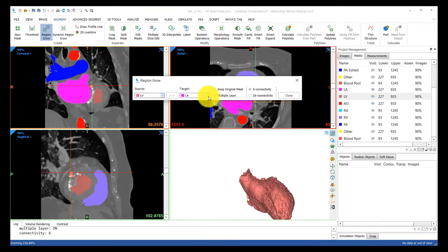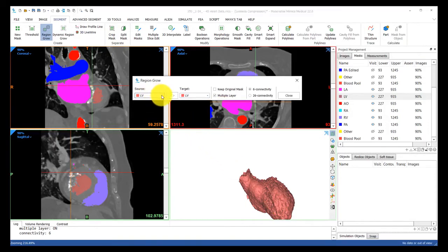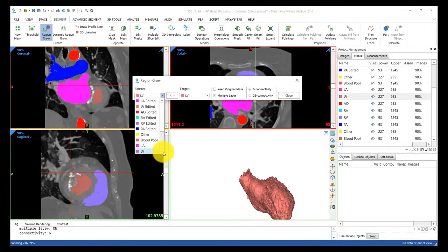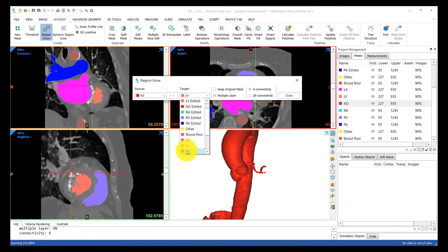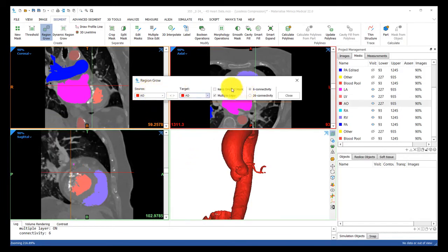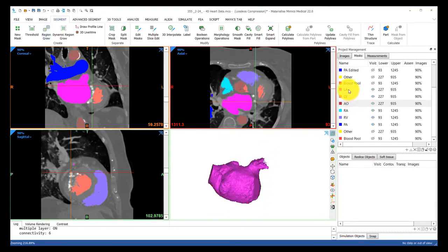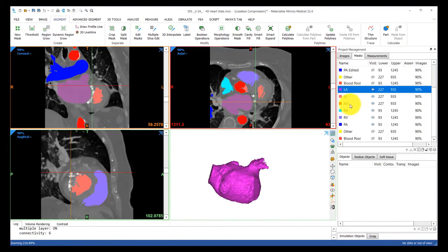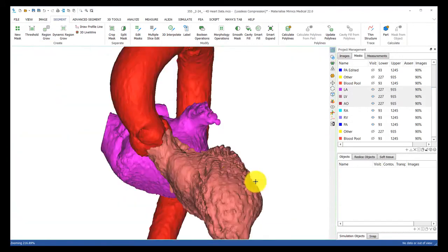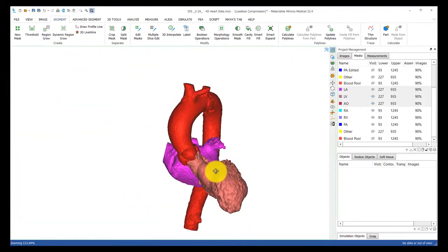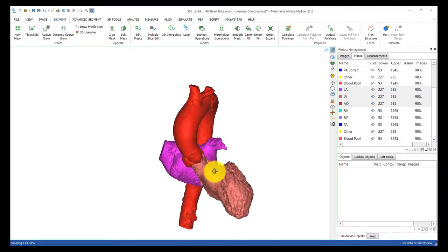You can see since the CT heart tool already labeled these so nicely for me, I'm going to make sure my target is the same mask as the source mask and have my keep original mask option unchecked. That way, it will remove those unconnected pieces once I click on the model. And here's our final look.